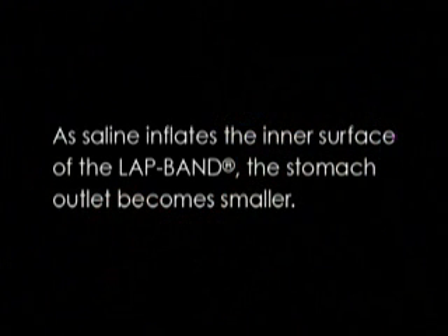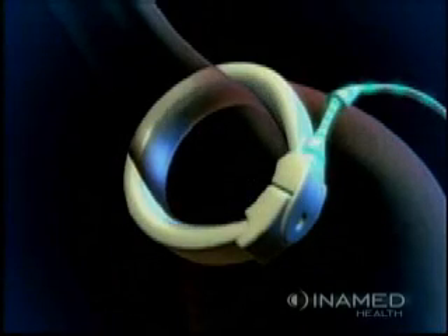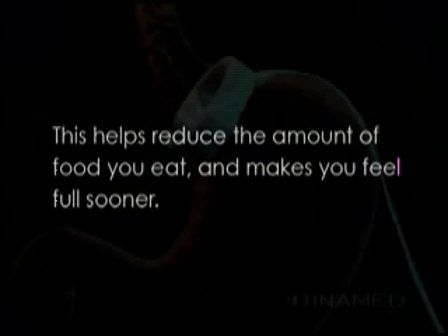As saline inflates the inner surface of the lap band, the stomach outlet becomes smaller. This helps reduce the amount of food you eat and makes you feel full sooner.